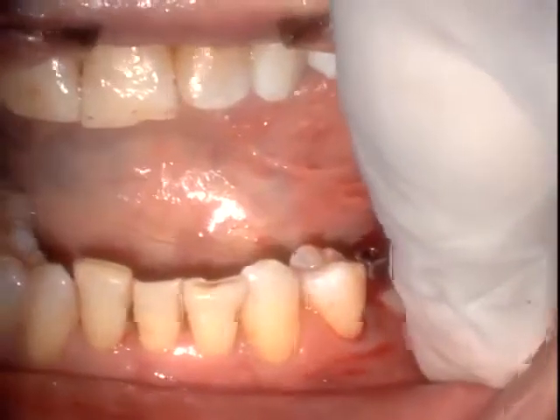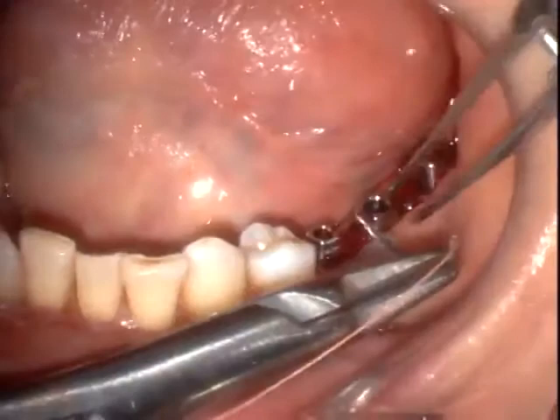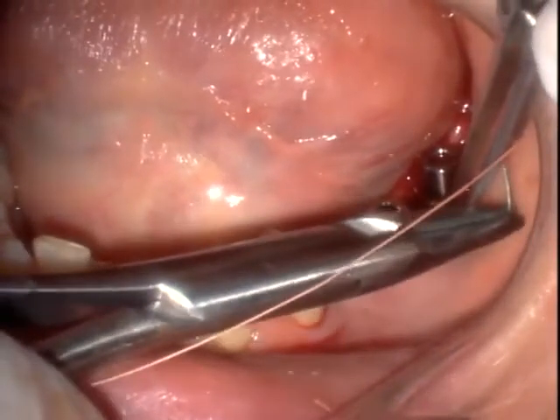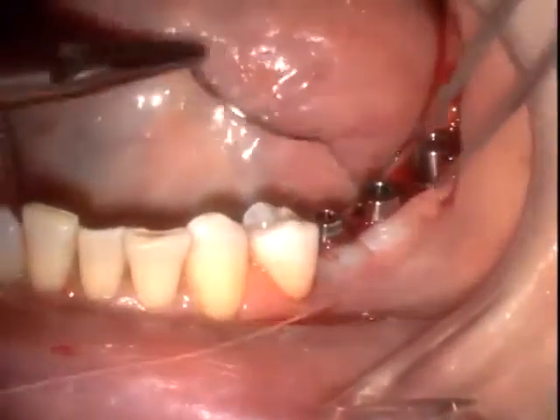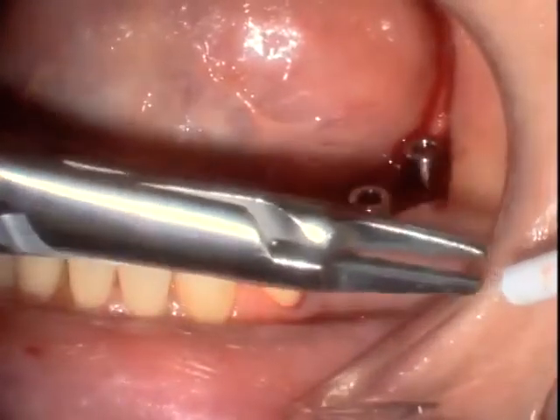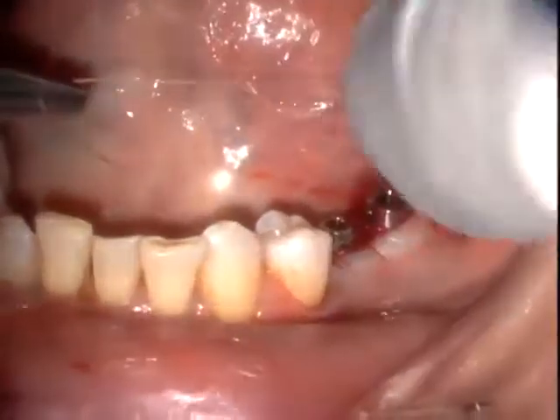So we've been able in one procedure to not only place the appropriate implants in their positions accurately, but also to augment the small dehiscences of bone on the buccal aspect of the distal 2 molar implants. Again, sling mattress sutures utilizing a 5/0 Vicryl suture is then utilized, and then interrupted sutures as we move distally.